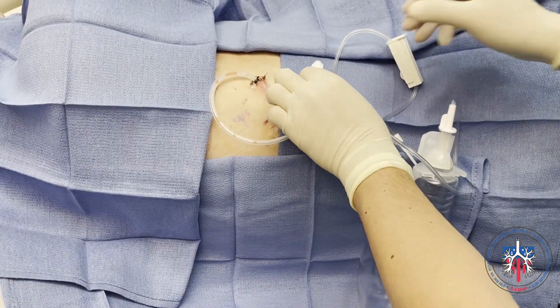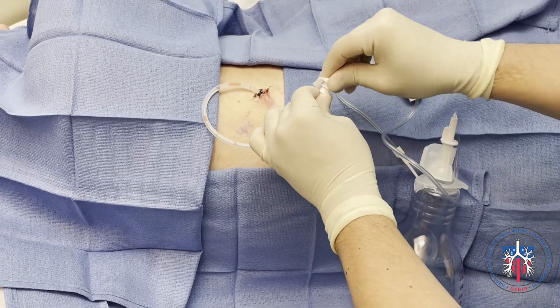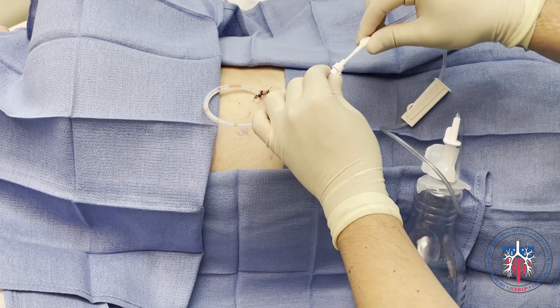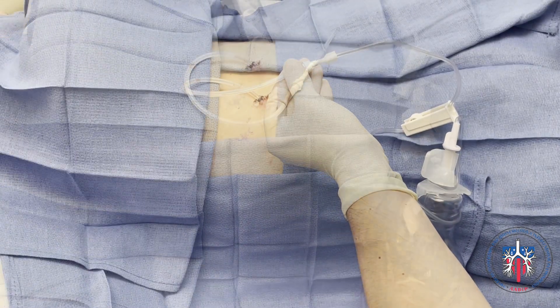Next, the valve cap is removed from the tip of the pleural catheter with a twisting motion and cleaned with an alcohol pad. The catheter from the tubing of the drainage bottle is inserted into the pleural catheter through the access tip. You should feel it snap in place.